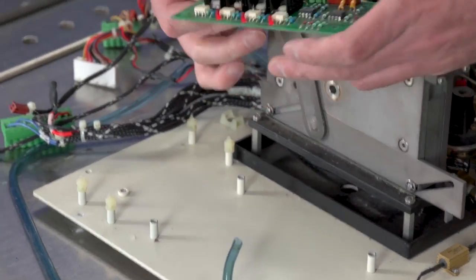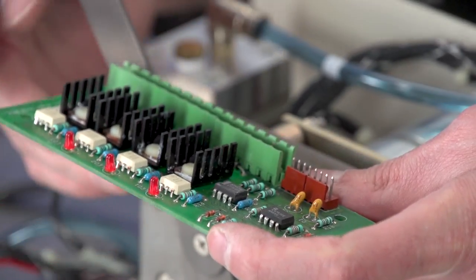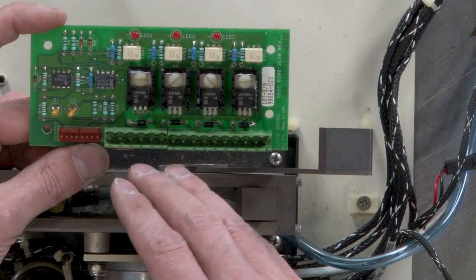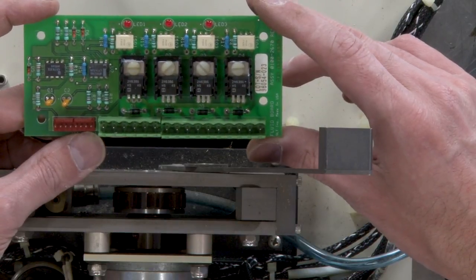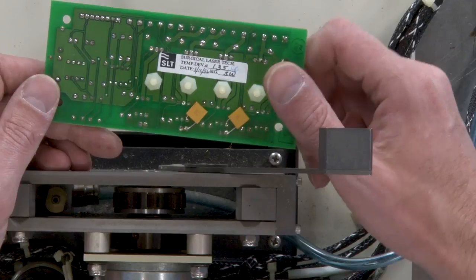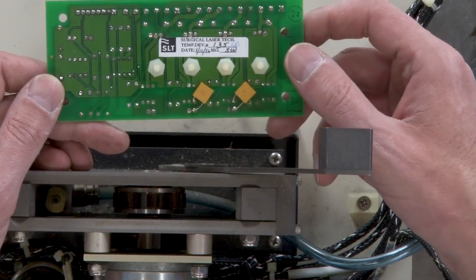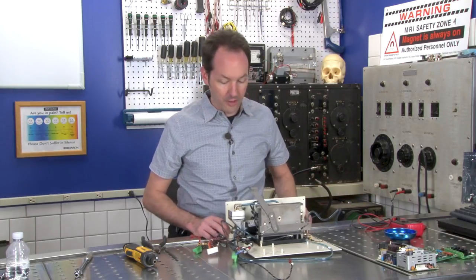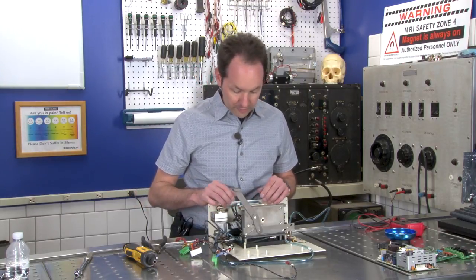This is a driver board — we've got a couple LEDs and some driver circuitry. This board is designed to activate four other systems; it's the fluid board, custom made for Surgical Laser Technologies. You can see a little bit of bodge work on the back. Now we're down into hardware, which is stuff I like a lot more than the electronics side of things.